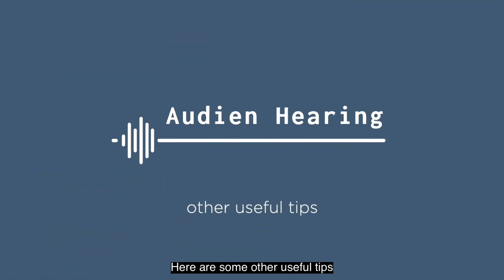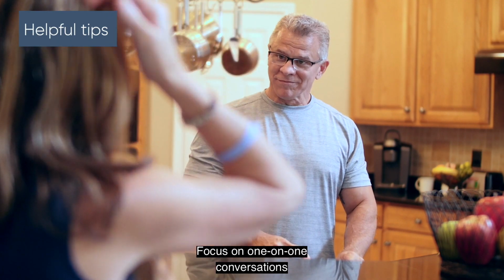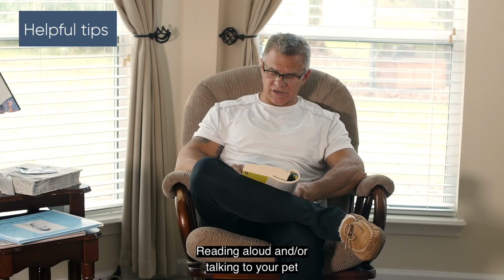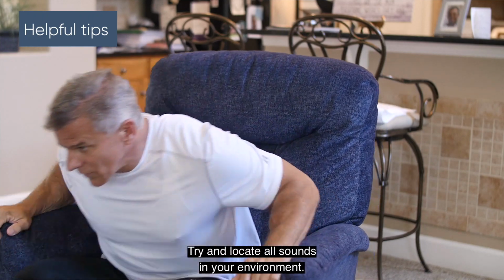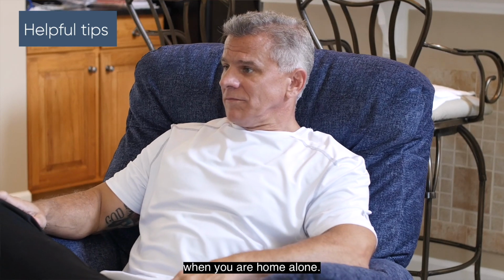Here are some other useful tips to help you in your hearing journey. Wear your hearing aids at home in quiet environments. Focus on one-on-one conversations and tell people you're still getting used to your new hearing aids. Reading aloud and/or talking to your pet will help you get used to the sounds of your own voice. Try these hearing activities. Try and locate all sounds in your environment. Listen to audiobooks and television when you're home alone.